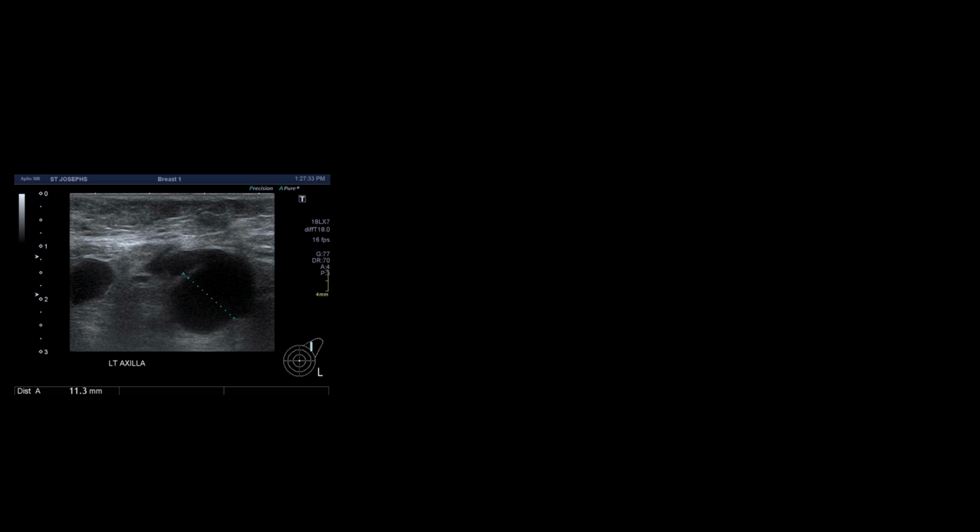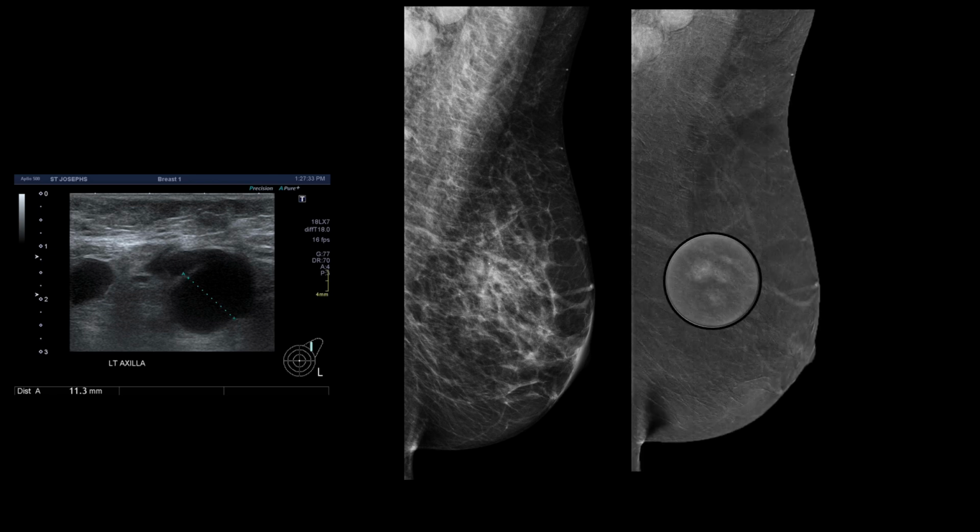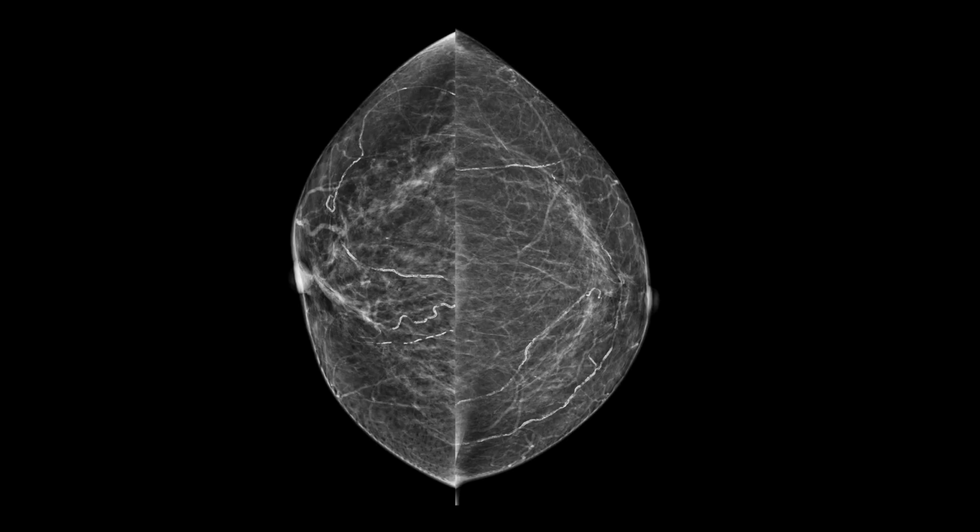And this is probably another excellent scenario. The patient presents with a palpable lump. I told you that we start with ultrasound. In this case, the lump was in the axilla. We see that. We examine the other axilla. We see that probably this is not lymphoma. It's probably metastatic disease. We don't waste time. We go directly to contrast enhanced mammography. Low energy does nothing, shows nothing. And we discover this. And now we can do the ultrasound and do the biopsy and confirm the malignancy. No need to send for MRI, get an appointment, all of this headache.